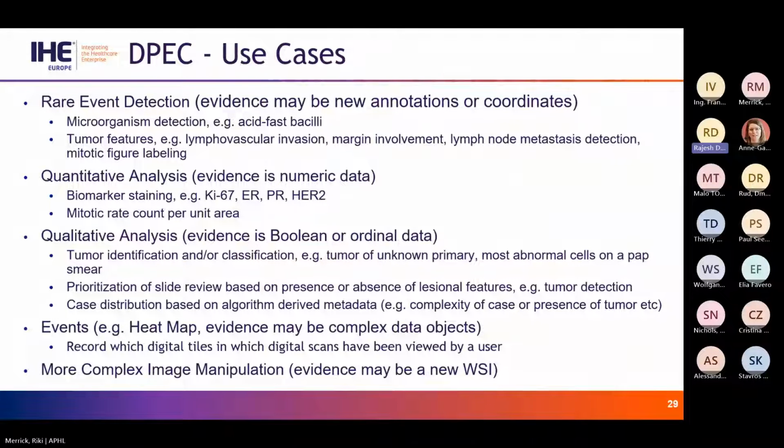So there are many new and exciting possibilities with this that go beyond just quantitative and qualitative data, such as creating new whole slide images or complex data objects. Really, the sky's the limit with machine learning and the ability to integrate that with digital pathology.